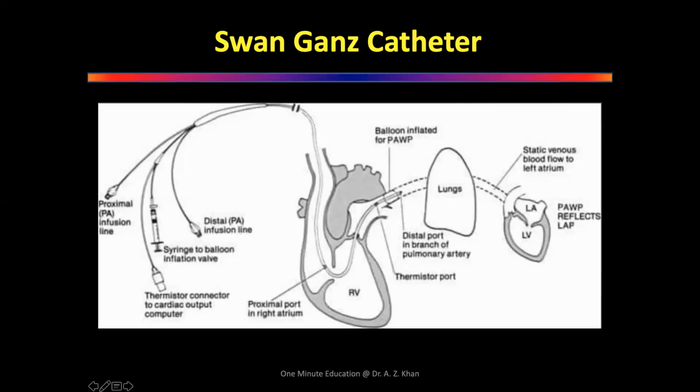So what diagram will be there when the PA catheter is in the RA? When it's in the RA, it will be similar to the jugular venous pulse. Yeah, so it will be JVP. Absolutely right. It will be like the JVP because JVP represents the RA pressure. What happens in the RV? It will be similar to the cardiac output tracing we have made, but with lesser peak pressures. Yeah, so there will be contraction and a higher peak of the tracing.